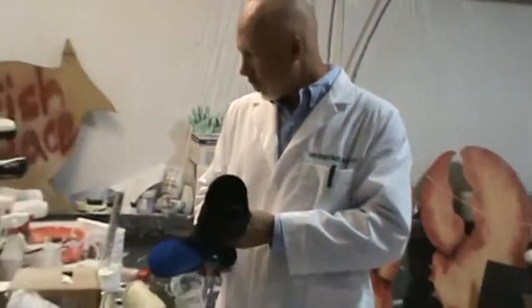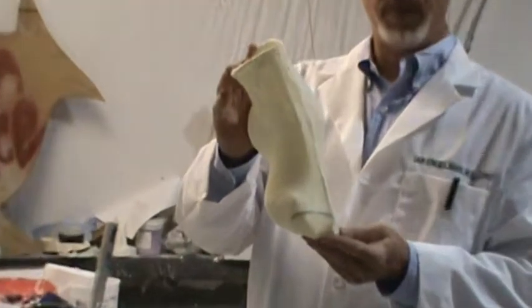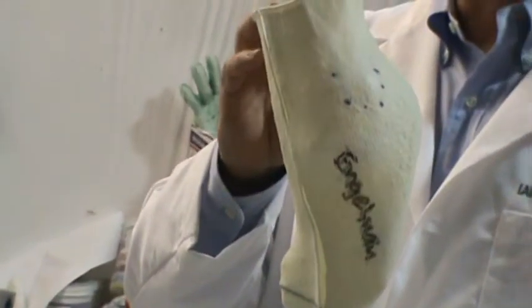So recently I got this case here. This practitioner asked for cuboid lock design.